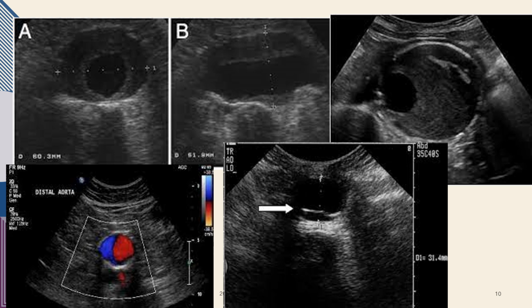What you also see here is, knowing that there's an aneurysm, the tech or practitioner may have to adjust that B mode imaging to demonstrate that there is truly a thrombus surrounding that within that aneurysm. And so if we put color on this, it might actually look relatively normal in size because of the thrombus decreasing that lumen. But when you take the color off, you evaluate in B mode, you can really identify that there is an additional issue going on here.